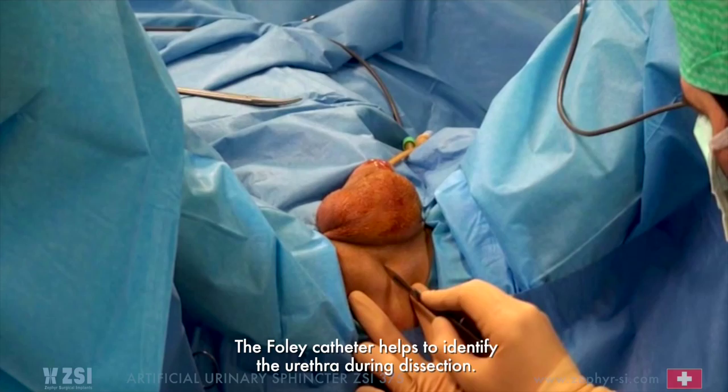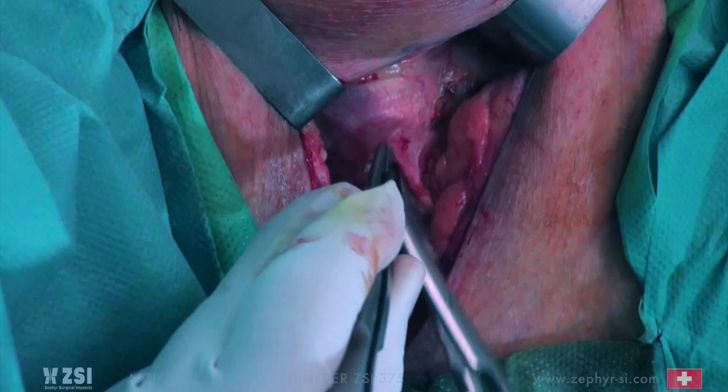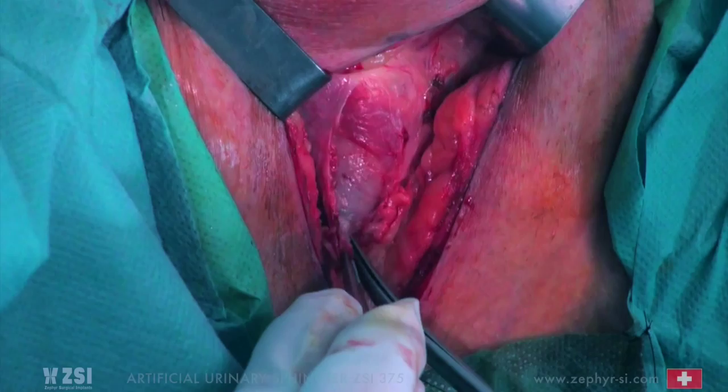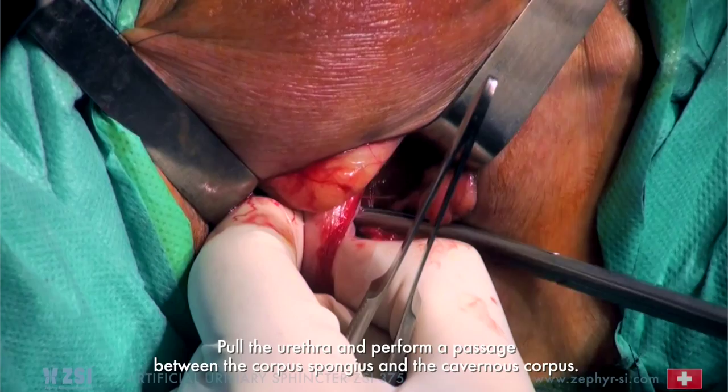Perform a perineal incision and dissection. The Foley catheter helps to identify the urethra during dissection. Dissect the fat in the bulbospongiosus muscle covering the urethra. Dissect 2 cm of urethra. Pull the urethra and perform a passage between the corpus spongiosum and the cavernous corpus. Handle the scissors with care.